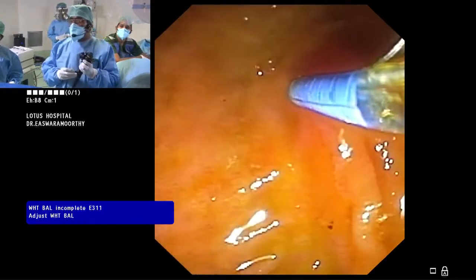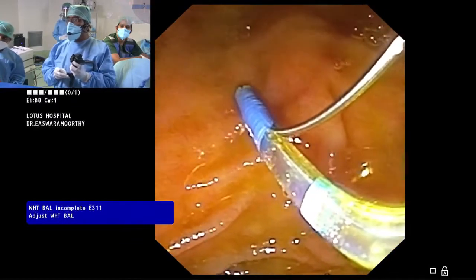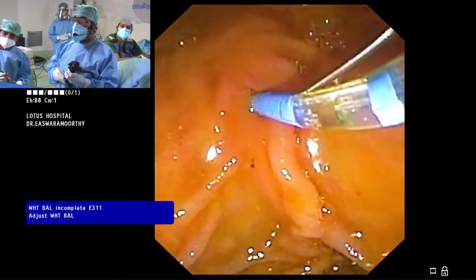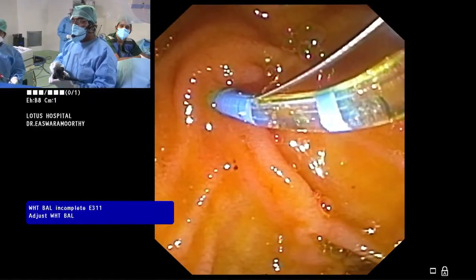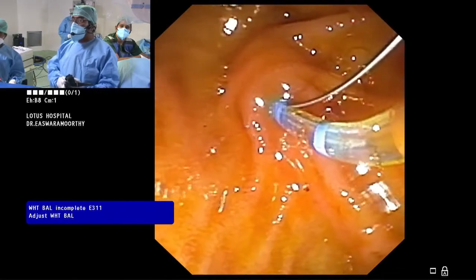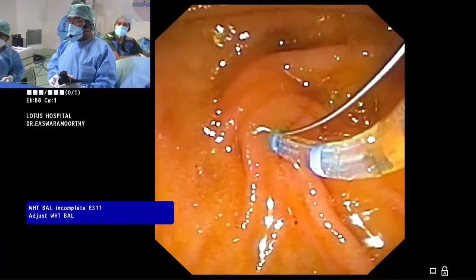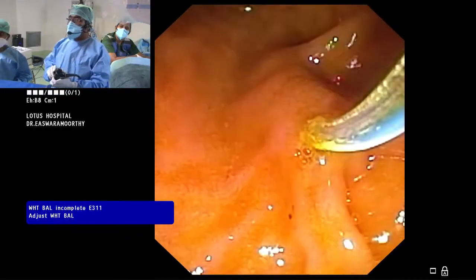So we are now interested. See, now I'm just going to go this way. This is the way I want to go. It's important to have the correct angulation, otherwise you tend to get into the pancreatic duct instead of the CBD. I'm just kissing the guide wire. So the main thing is, this is the ideal position. I got the right angulation, and you see the ampulla.